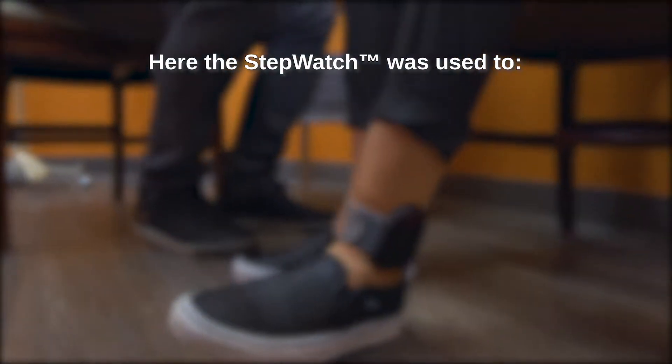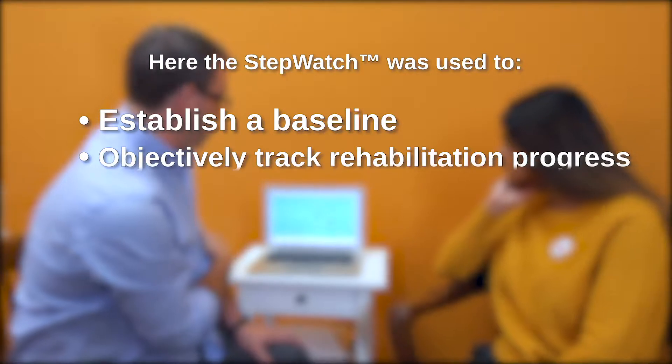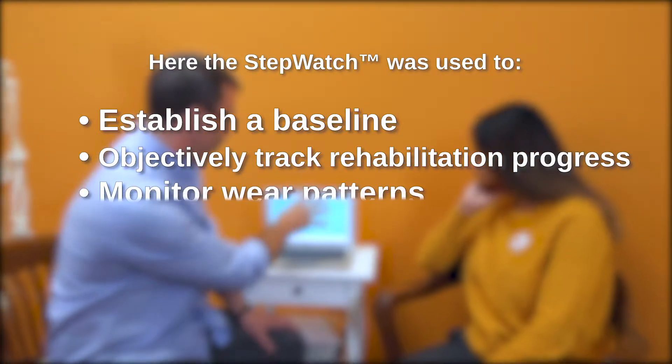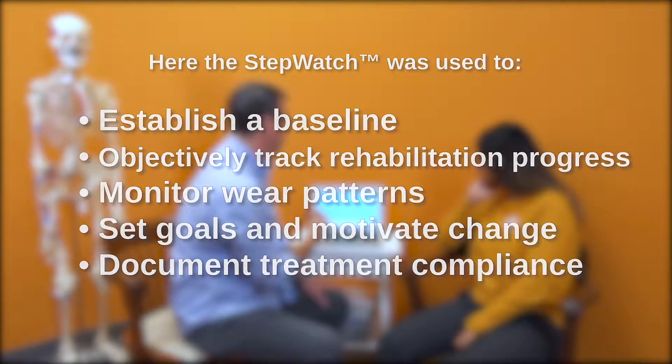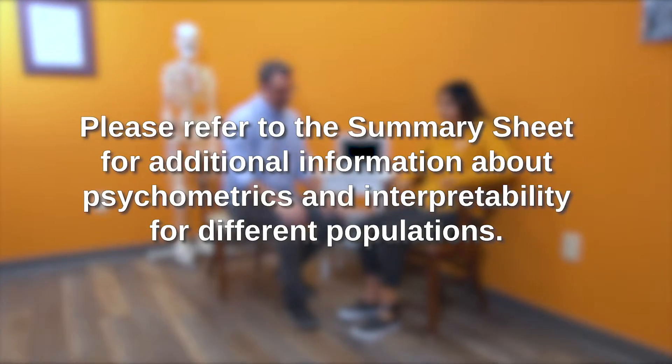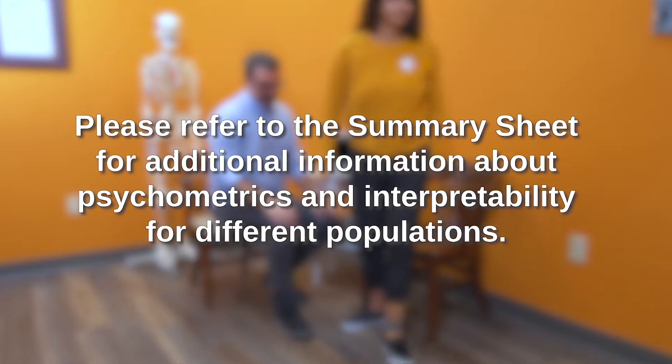Here the StepWatch was used to establish a baseline, objectively track rehabilitation progress, monitor wear patterns, set goals and motivate change, and document treatment compliance. Please refer to the summary sheet for additional information about psychometrics and interpretability for different populations.